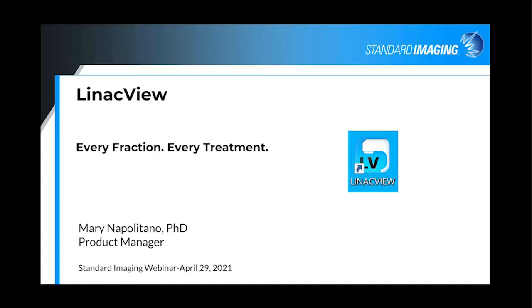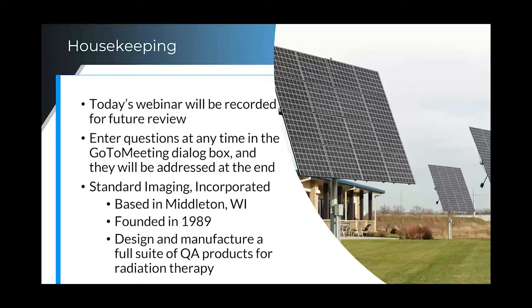And today I'm going to talk a little bit about why you should use LinacView for every fraction of every treatment. Today's webinar will be recorded for your future review. At any time, you can enter questions into the GoToMeeting dialog box, but I will most likely not answer them until the end of the session.